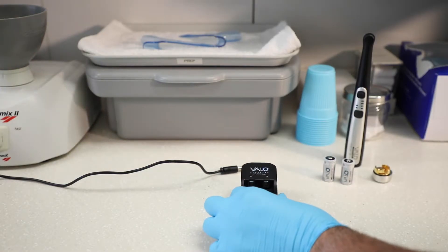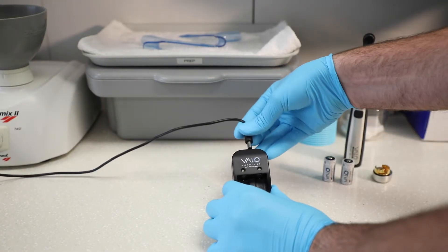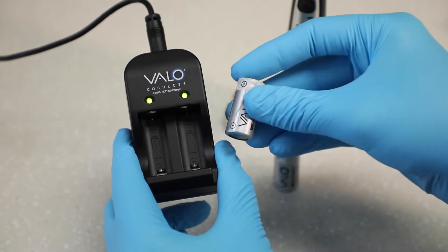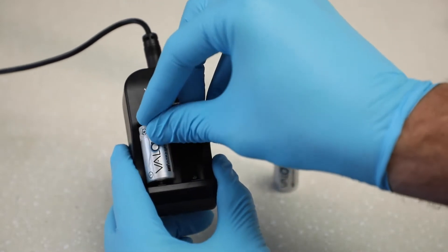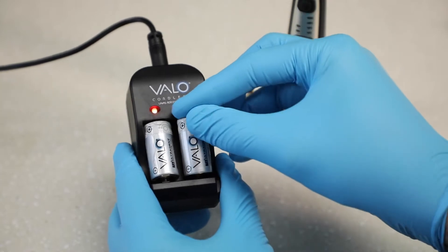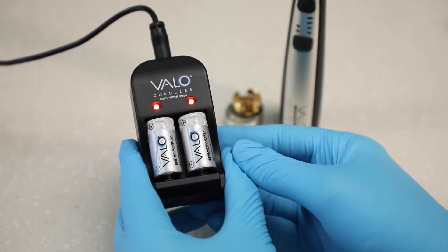To charge the batteries, plug the charger into an electrical outlet in an office area, avoiding areas where disinfectant spray may come in contact with batteries. Insert the batteries into the charger with the positive ends pointed towards the indicator lights on the charger.